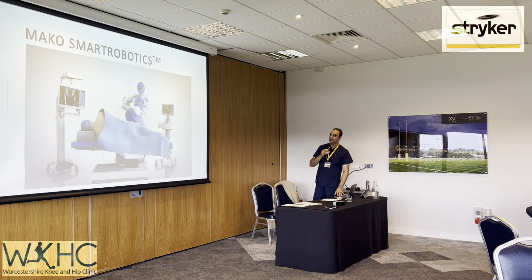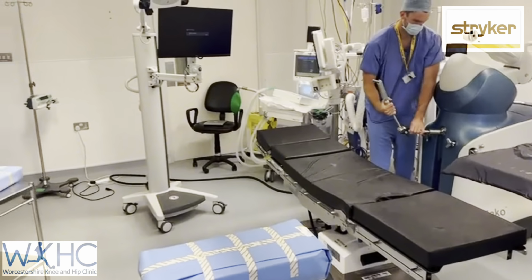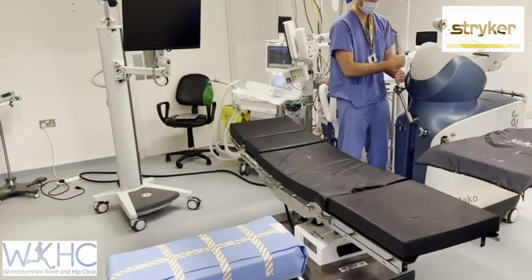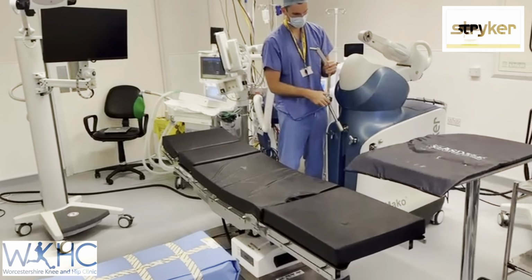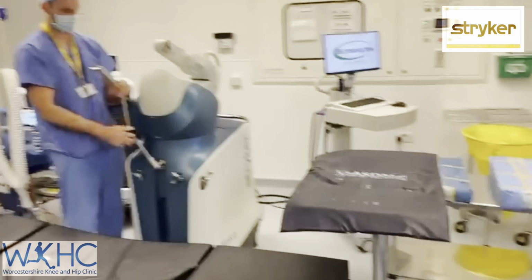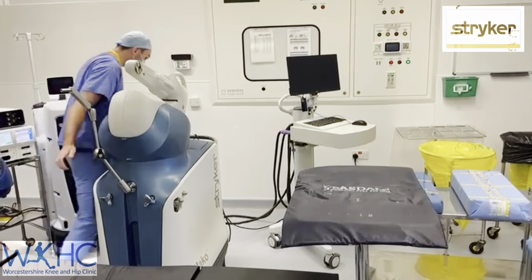So what we found is that the camera position, we're going to show you where we position things now. For a hip, this is the layout that we have. The robot will come from the opposite side. This is a right hip that we're doing. So Cole is setting up the robot there.